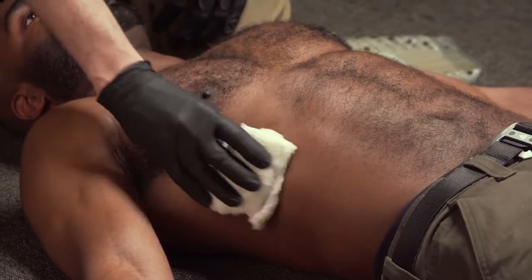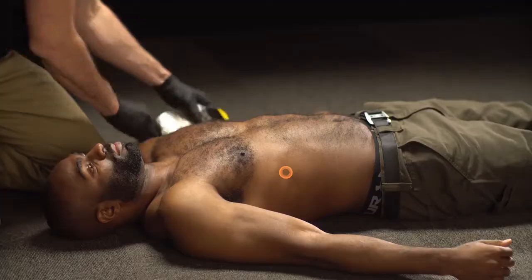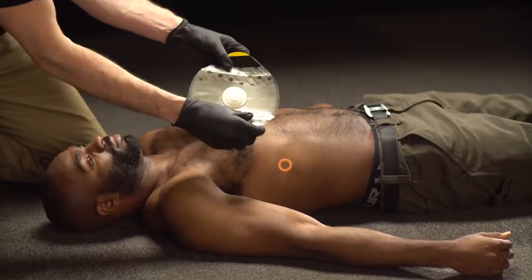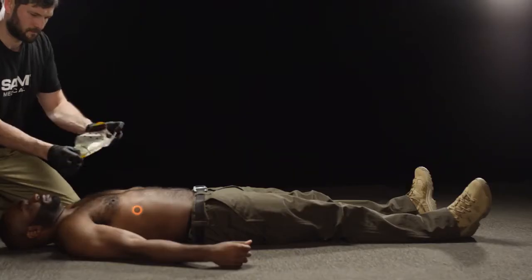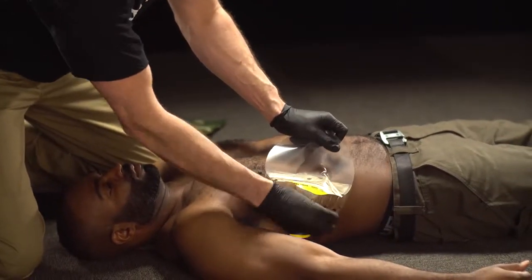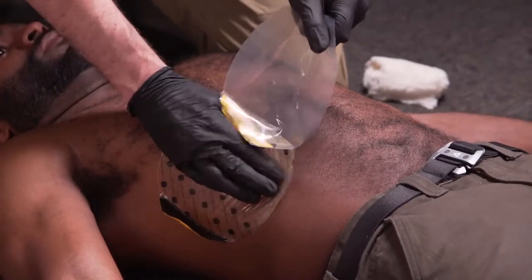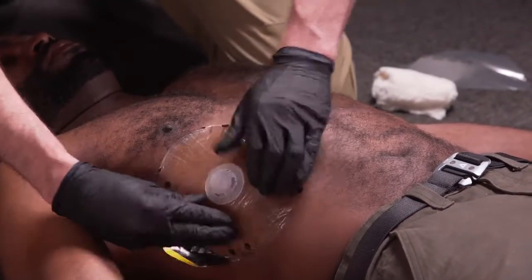Clean the wounded area. Next, grip the application tab and remove the clear liner. Center the TruFlow Valve over the wound and place the dressing adhesive side down before pressing firmly across its entire surface to ensure adhesion.